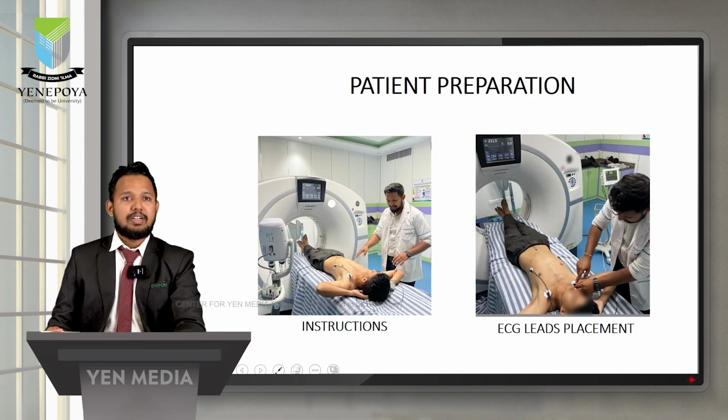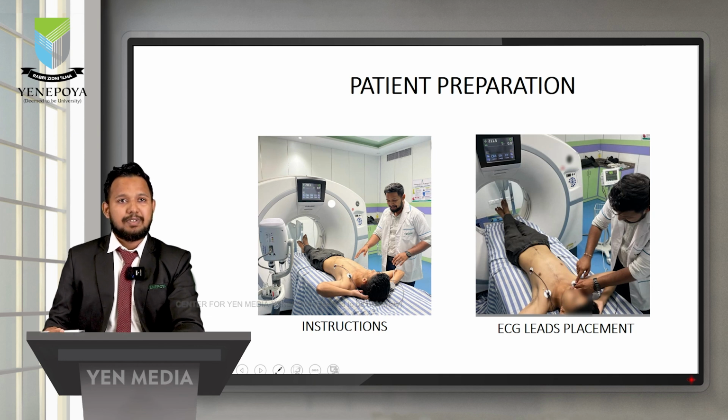We also have to instruct the patient before the patient is scanned. Usually when the patient is put on the gantry table, the patient will get anxious because of the machine. So we should instruct the patient properly so that the patient doesn't move or his heart rate doesn't increase in between the scan.